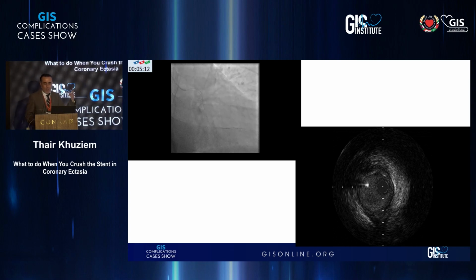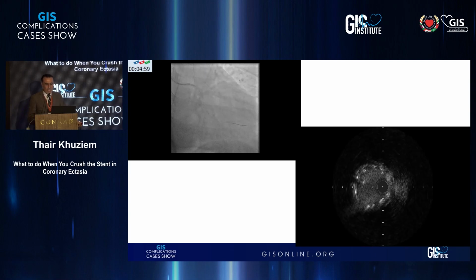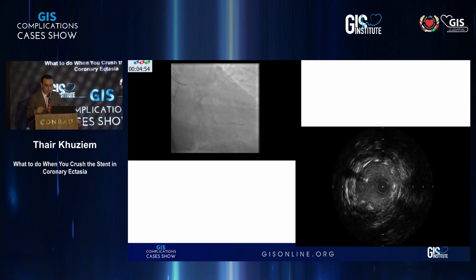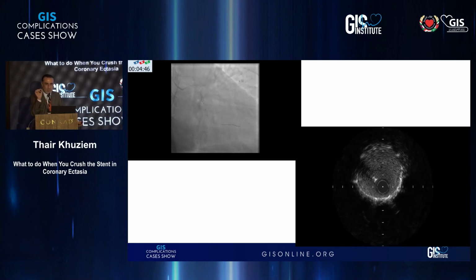stent. At the beginning, we thought that probably the IVUS catheter contacted the stent, so probably this is the difficulty. And after that, the IVUS passed easily distally, and we look to the distal part of the stent. I don't want to lose the time, but distally the stent is okay. Proximally there is an under-expanded or malapposed stent, but at the proximal edge of the stent, we didn't realize.